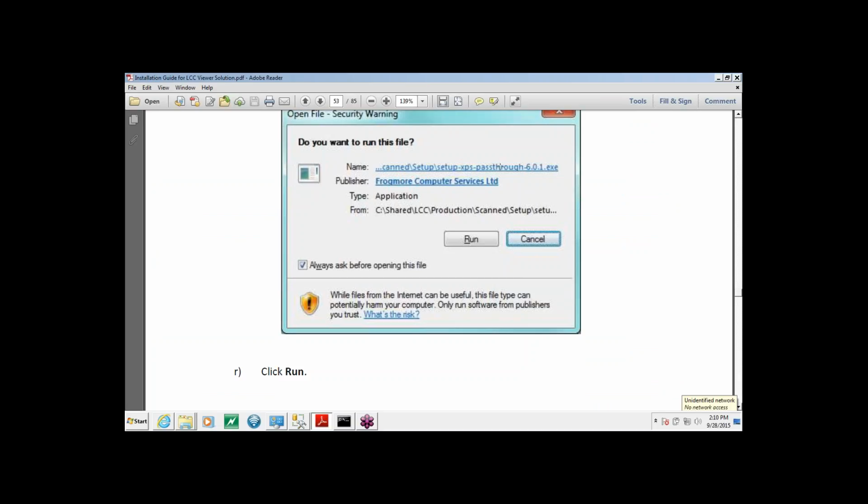For your information, I actually didn't put it in the guide, but I noticed that this driver cannot be installed on Windows 8 or Windows 10, and is not required on Windows 8 and Windows 10.